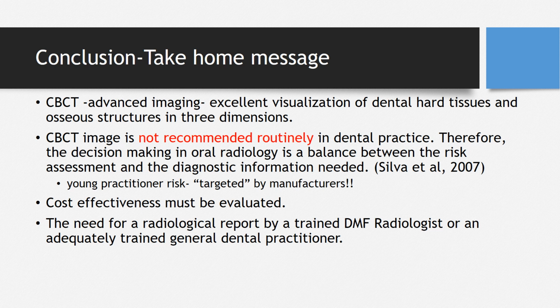Also, cost effectiveness must be evaluated. So, the need for a radiologic report by a trained radiologist or an adequately trained general practitioner is also very important. So, you must train yourself how to use the three-dimensional software, which is not very difficult and can be done. And once you're confident, you wouldn't miss a finding in the scan.